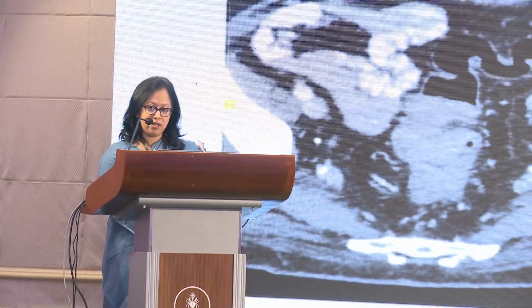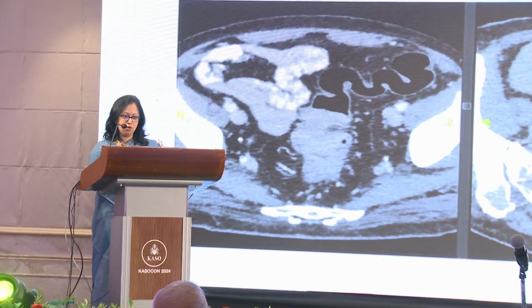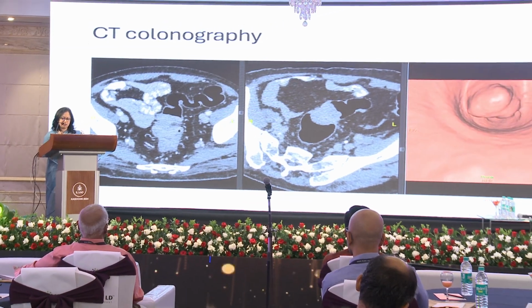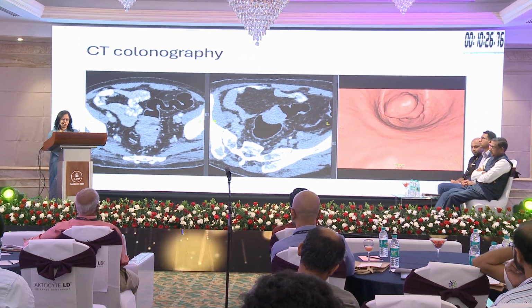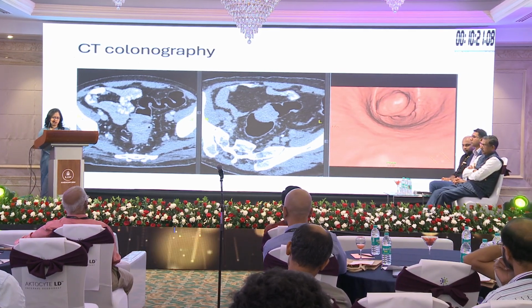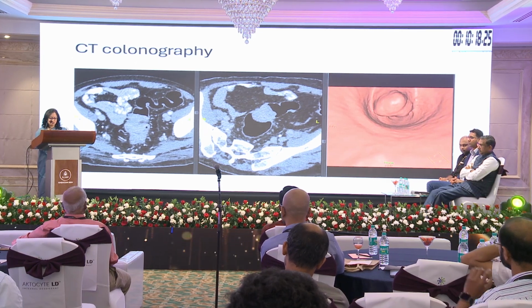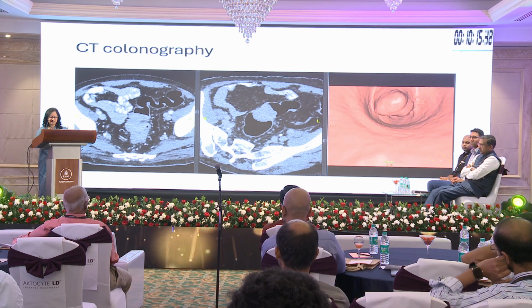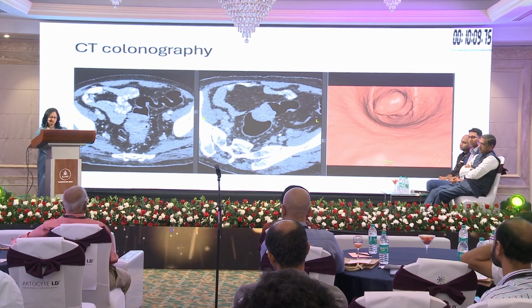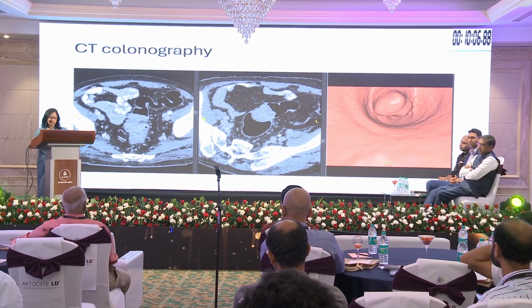But oftentimes in our practice, CT colonography is only done in patients where endoscopy could not be done, in a very elderly, frail patient, or when the patient refuses to undergo a colonoscopy, or in a patient with an obstructed cancer where colonoscopy could not be done, or colonoscopy-failed patients. Those are the kind of patients we would opt for a CT colonography in our practice. This is an example of a polypoidal growth detected in an 82-year-old patient who could not undergo a colonoscopy. In these patients, CT colonography would be the modality of choice.